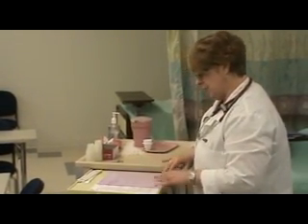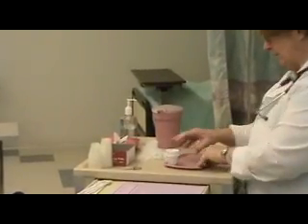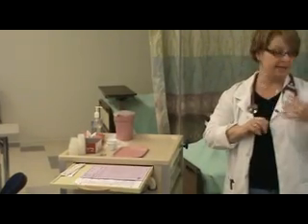First, let's take a look at what equipment we need for this process. We need the MAR, we need medication cups, we need a tray. We're going to need a pill crusher. What I could verbalize to my instructor as I'm doing this is that prior to coming into the med room to get ready, I've gone to take my patient's blood pressure, now that I realize that that's part of passing one of these meds, and I've delivered my piston syringe and irrigation set to the room, as well as my blue pad. So those things are in the room, so I don't have to try to juggle all of that while I'm out here. I've let Mr. Baptiste know that I'm coming with medications shortly. And you can do the same thing.